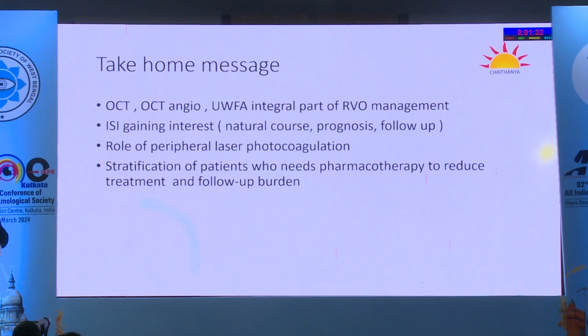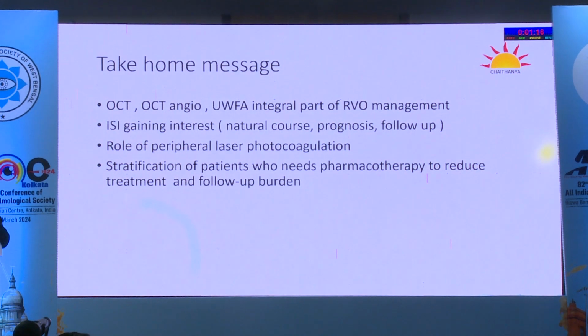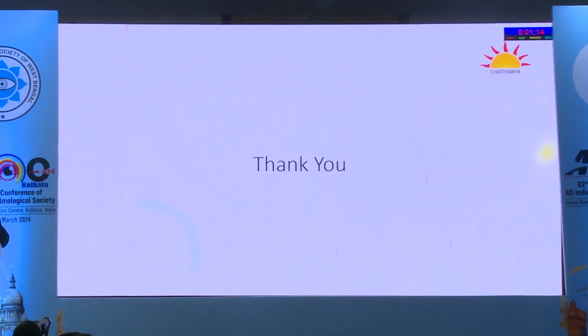To take home, OCT angio and ultra-wide field imaging have become an integral part of RVO management for me. ISI is gaining interest, as is the role of peripheral laser photocoagulation. And last but not the least, stratification of patients who need pharmacotherapy to reduce treatment and follow-up burden. Thank you very much.